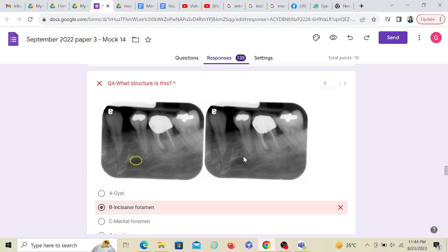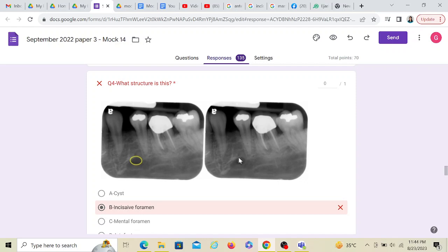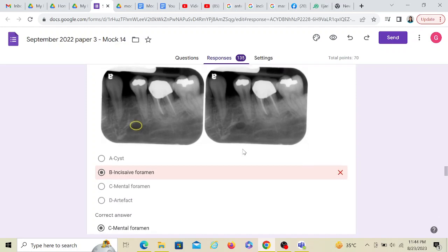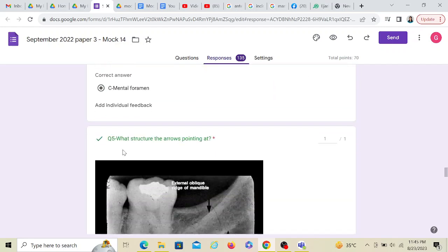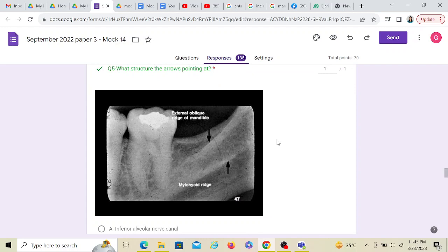This doesn't look like it, though the differential diagnosis can be that. This is a classic place where the mental nerve erupts or rather comes out of the mandible. It's called a mental foramen. Its location is between the roots of the two premolars, and one premolar is not here, so yes, this is mental foramen. If a premolar was here with carious involvement of the pulp which was seen on the radiograph, and the apex of the tooth was ending here, and there would be superimposition of this over the root, then you may have marked it as a radicular cyst. But thankfully that is not the situation here. Hence we go with the mental foramen. It's not an artifact. If this was present somewhere at the bottom out here, I may have thought it's an artifact.